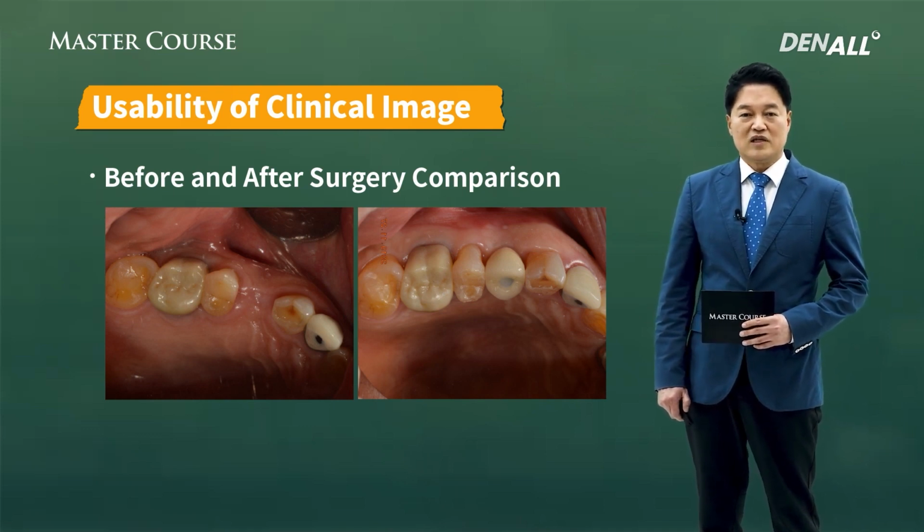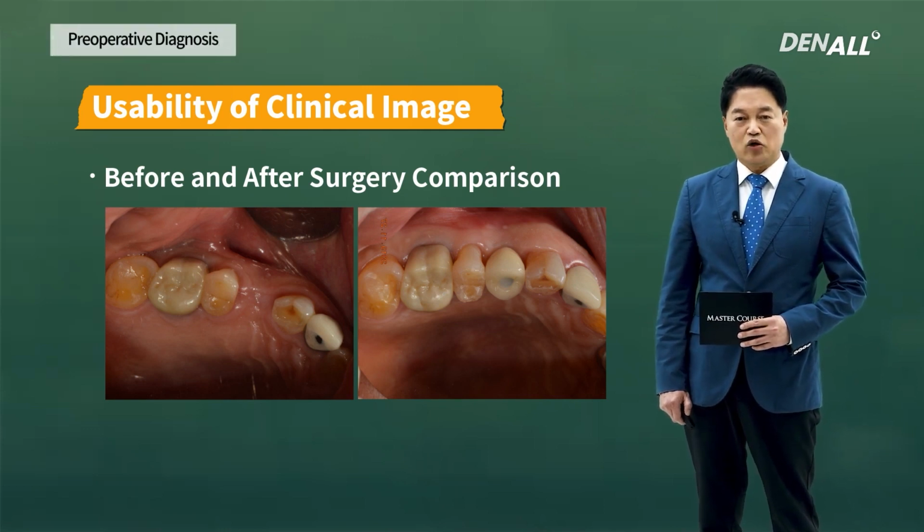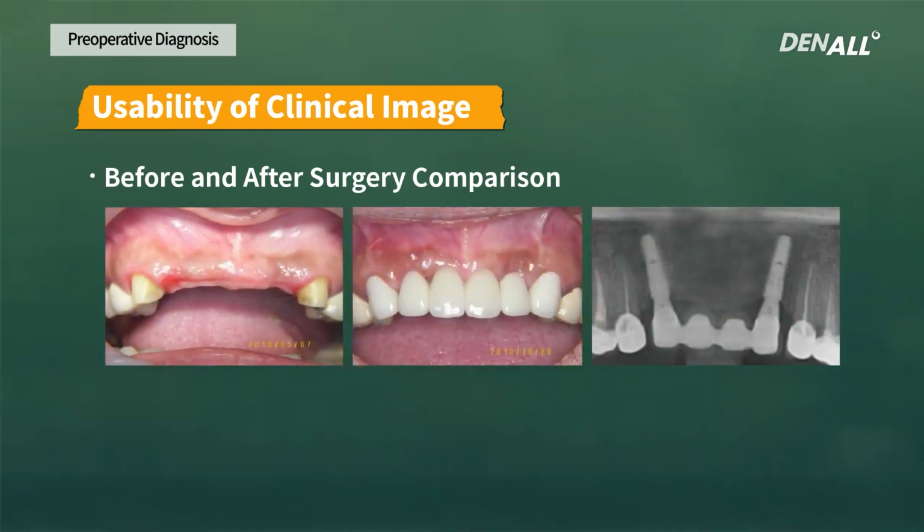If there is implant complication, you'll be able to build a solid foundation for providing explanation. In the anterior area, by comparing before and after image, you'll be able to explain more easily. If something goes wrong, you'll be able to understand better what went wrong.